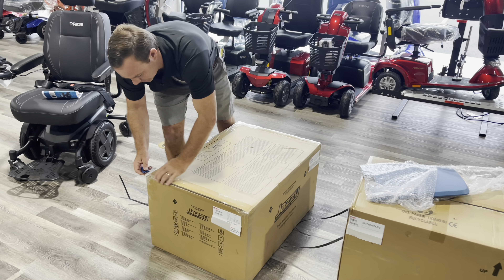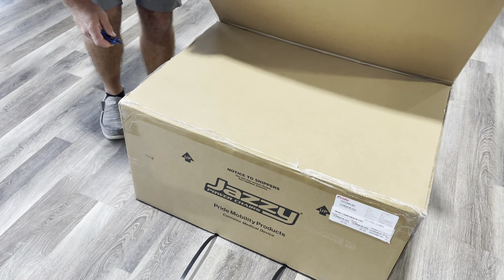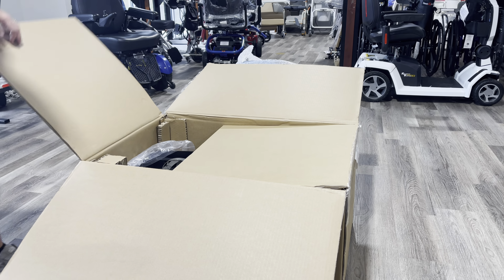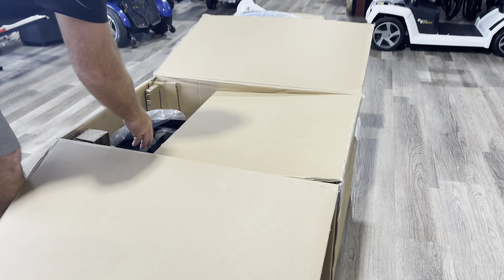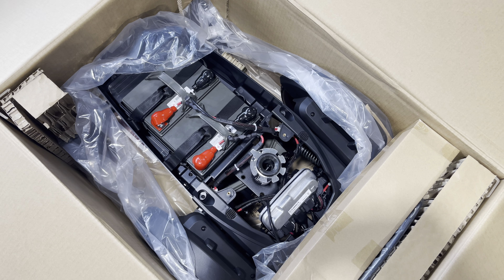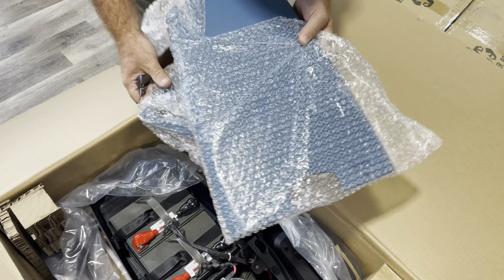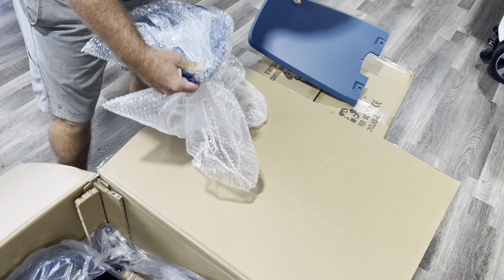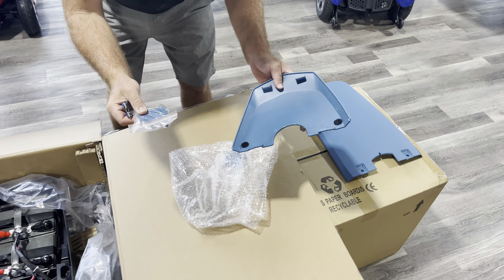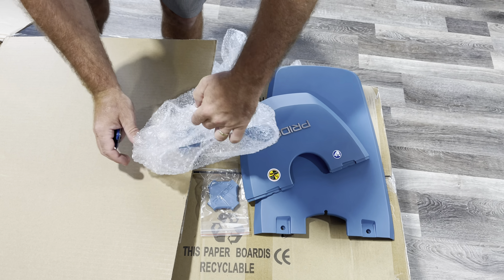Out here are serial numbers - make sure the box is not damaged. This box with the standard batteries, I believe this is like 189 pounds - now it might be less because they're combining the seat with it, so let's say about 140 or something. Inside it's packaged well. There'll either be the shrouds in this unit or they'll come separate. Here are the shrouds - they came in a separate box. There are two different shrouds and then you have your connectors for the feet or wheels. All this is very easy to put on.